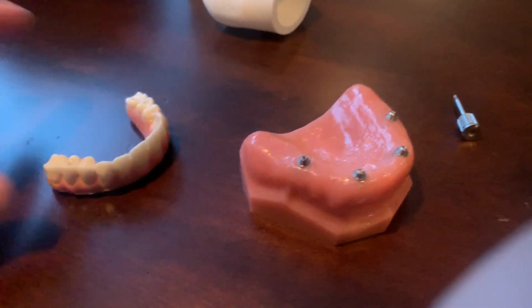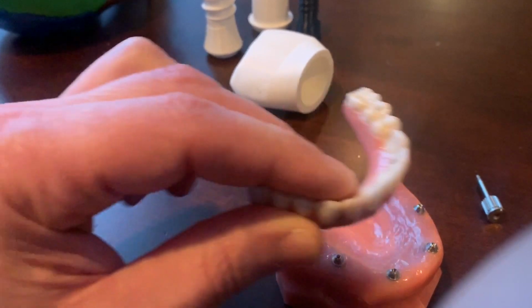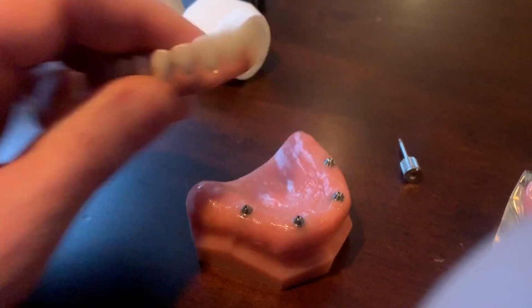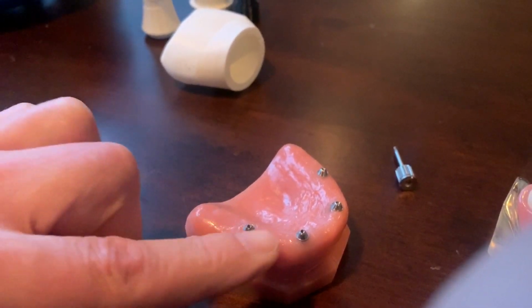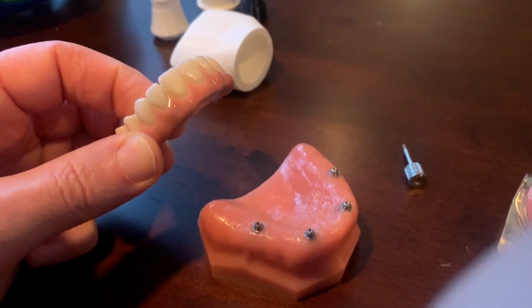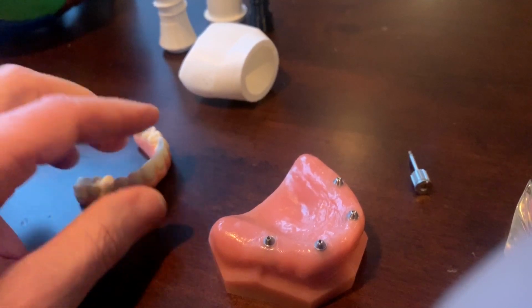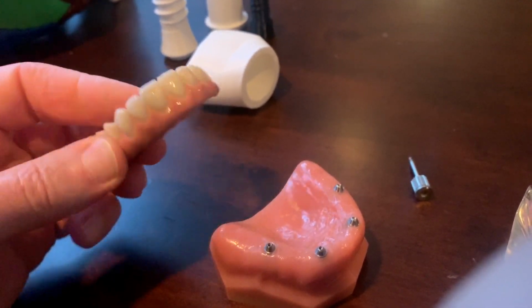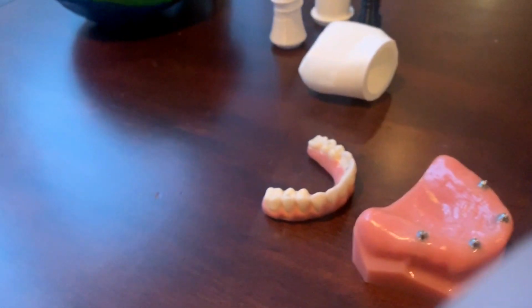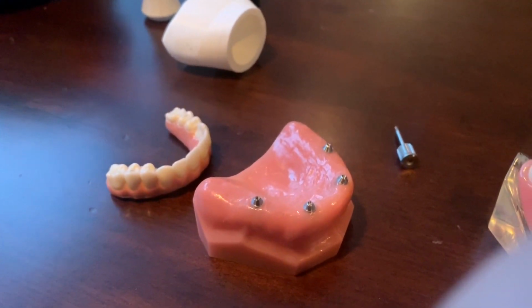If you go with the bare minimum, this piece right here is very expensive. Let's just say, to be the devil's advocate, you put this on here and everything looks great, and then 1 or 2 or 10 years later, one of these implants fails. Well, guess what? These implants are where they are, and they permanently fix on here in a very exact way. So this whole bridge would need to be remade, and an implant would need to be put back in here. And this bridge, $10,000 plus easily to get that nice piece of hardware made. That's a huge investment to watch go down the drain.